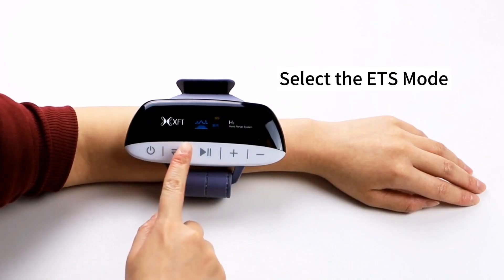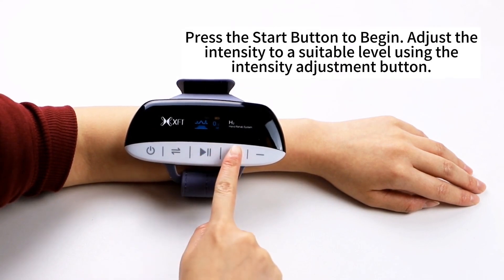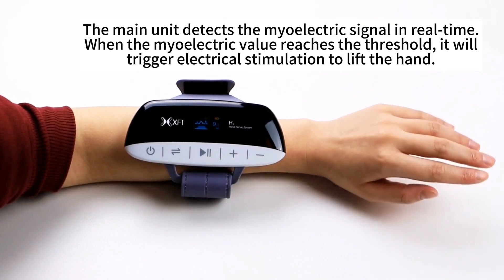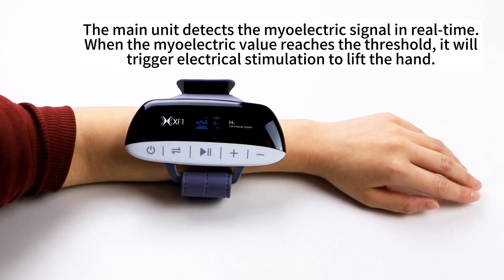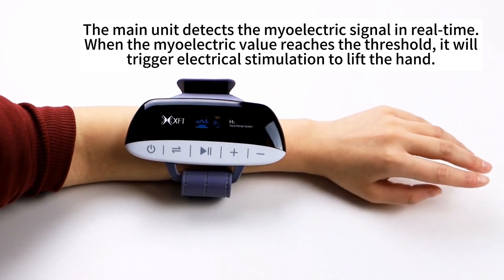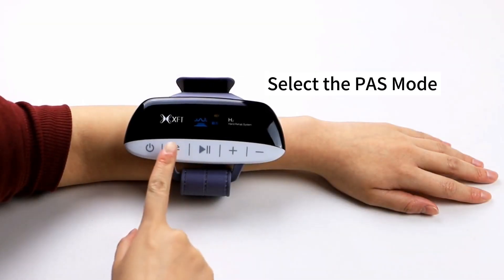Select ETS mode. Press the start button to begin. Adjust the intensity to a suitable level using the intensity adjustment button. The main unit detects the myoelectric signal in real time. When the myoelectric value reaches the threshold, it will trigger electrical stimulation to lift the hand.